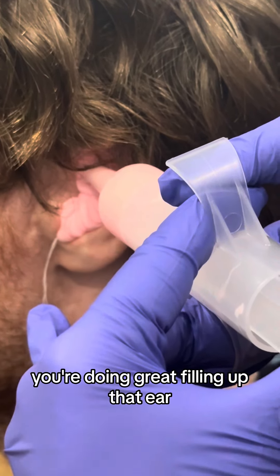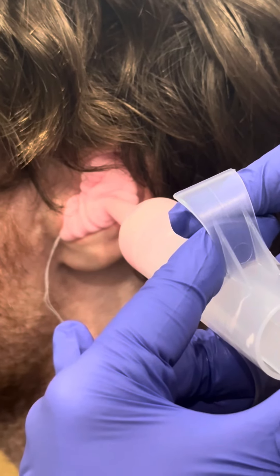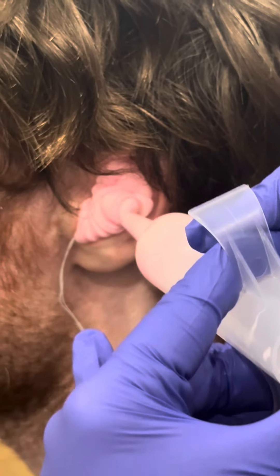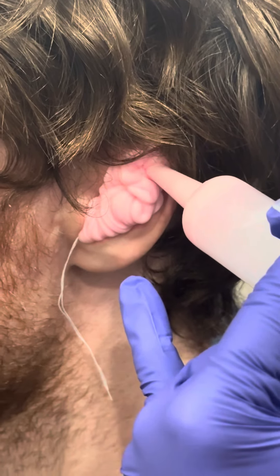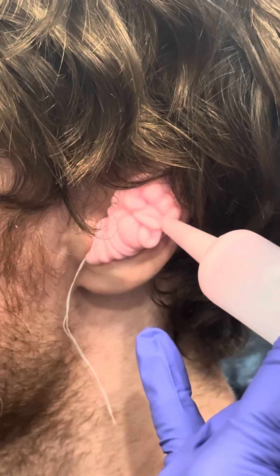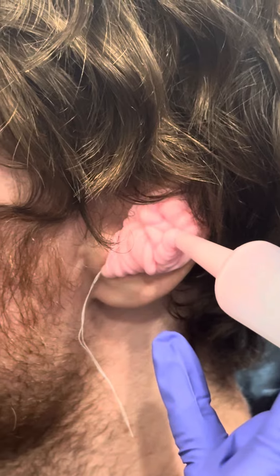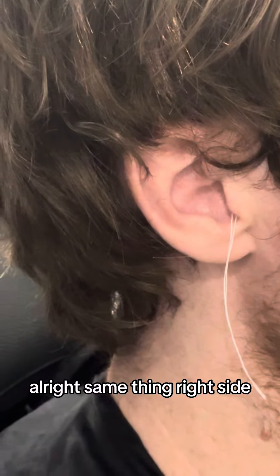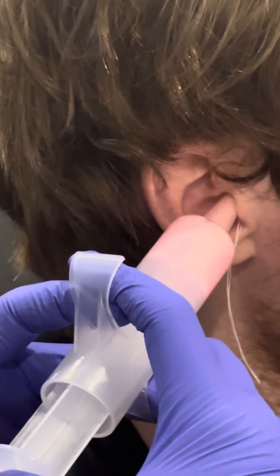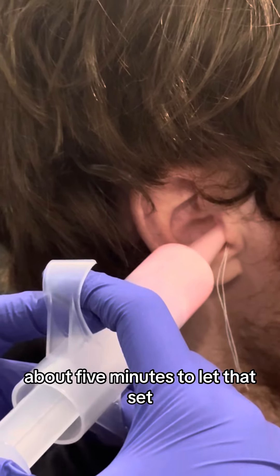You're doing great filling up that ear. Same thing, right side. You're not going to be able to hear anything for a couple of minutes — about five minutes to let that set.